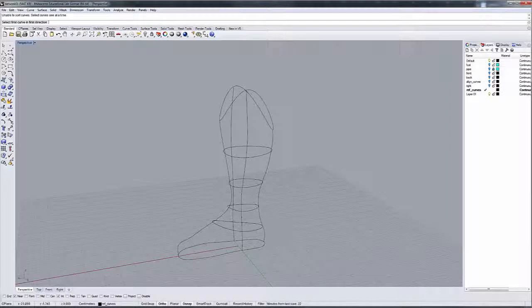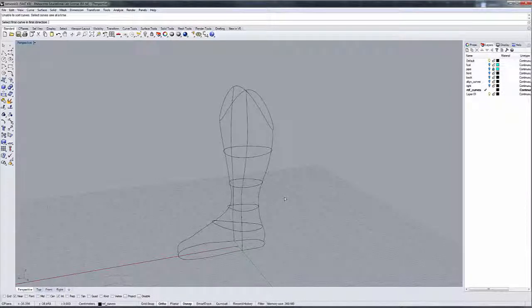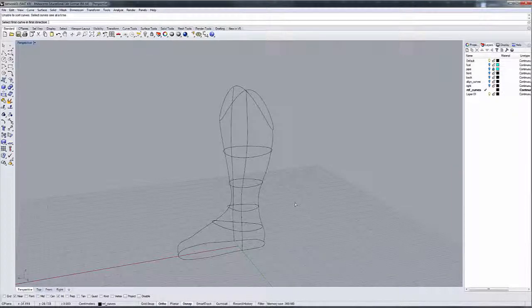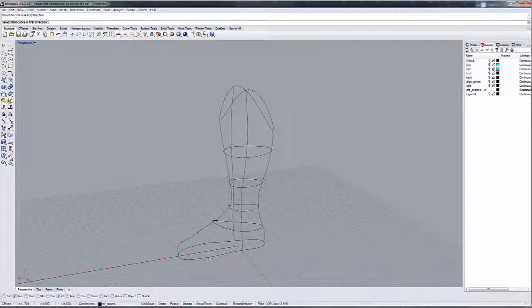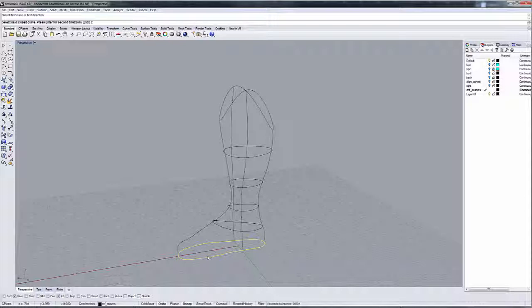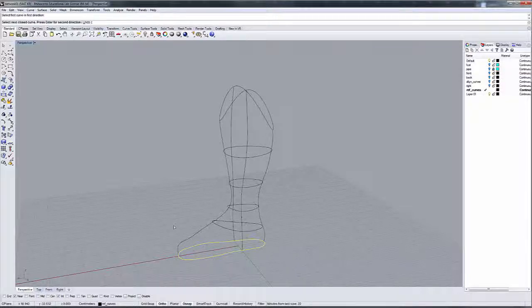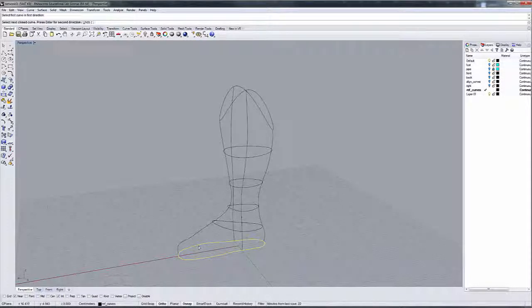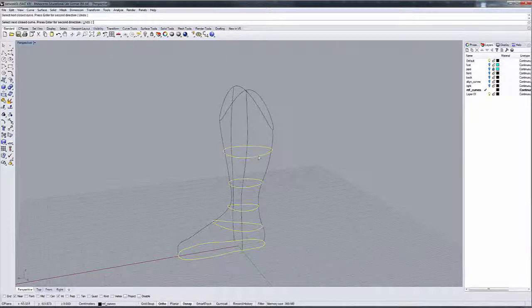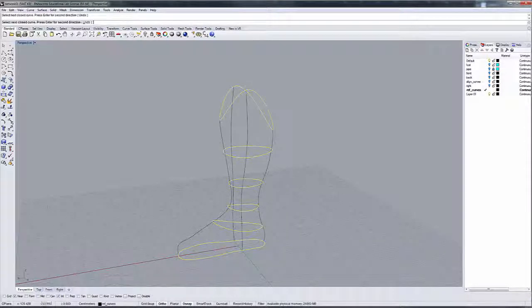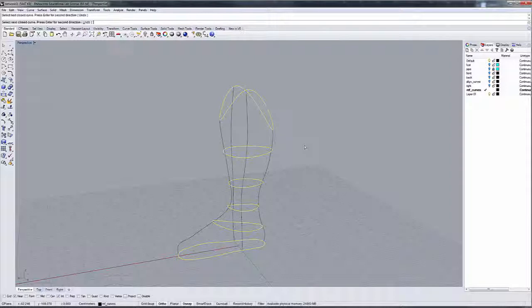But before we do that, I'm going to do it once so we can see how the command works, and I'm going to do it again with record history on. So I'm going to start with these curves right here, and you note that it says select next closed curve because that's a closed curve. So this is the first direction. These are all closed curves, and I've selected them.